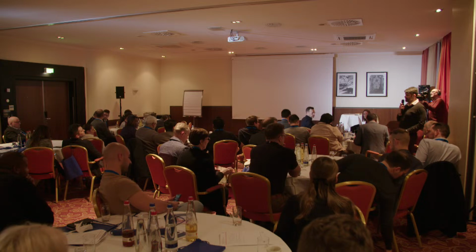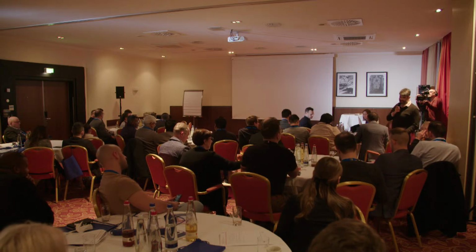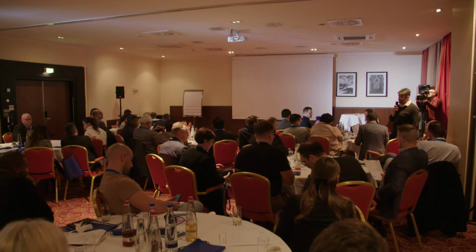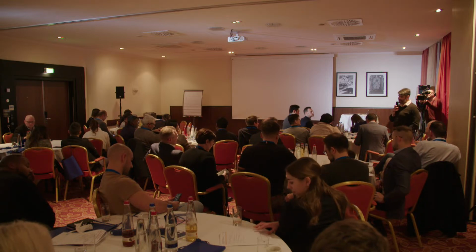Where I'll start by talking about vessel prep choices in heavily calcified lesions and how IVUS helps us there. And then we've got some other talks about other vessel prep strategies from Philips. And then in the afternoon, we'll spend some time in the sort of individual workshops going around and getting some hands-on experience with the software.